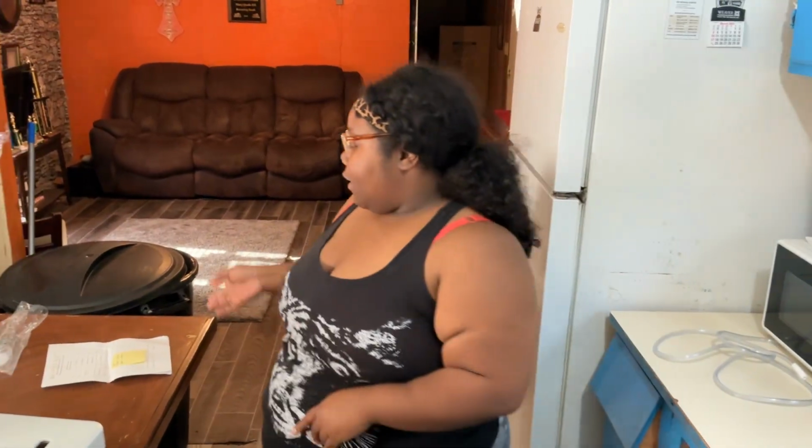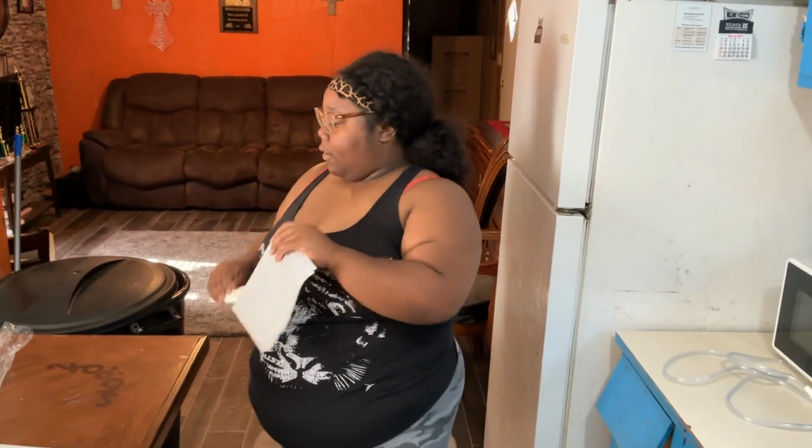This is my trach care suctioning video validation number 1. Before I get started, I'm going to review my physician's order. Okay, I reviewed my physician's orders for trach care suctioning, PRN, and I have an order for trach care. Alright. I'm going to perform hand hygiene. I'm going to foam in before I walk in my patient's room.